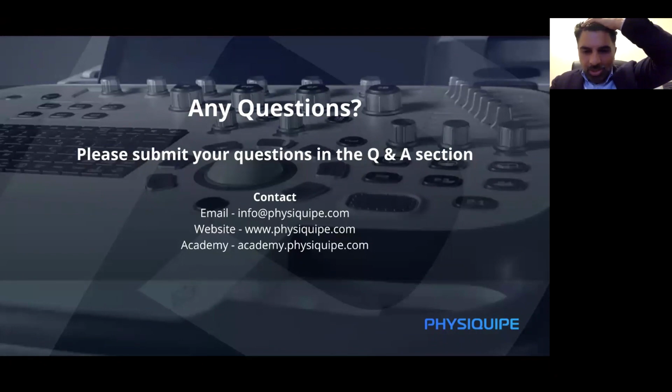Yeah, and sorry, Jamie, just to finally add, with ultrasound and rheumatology, people think that rheumatology is a disease of the joints. Yes, it is, but it's also a disease of the tendons and the pericapsular tissue, etc. So we look at patients and say, okay, you've got psoriatic arthritis, your knuckle joint is swollen, but is it the joint or is it the tendon? Ultrasound can differentiate that. And if it can differentiate that, you can guide the injection directly into that region.